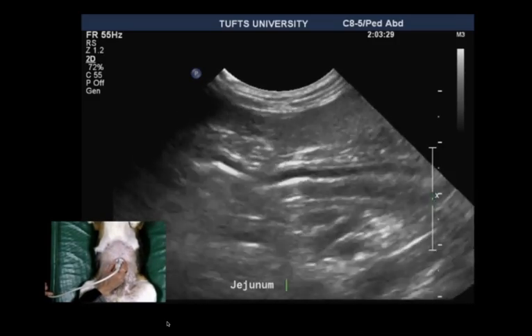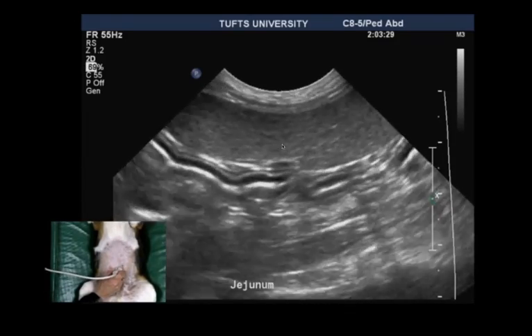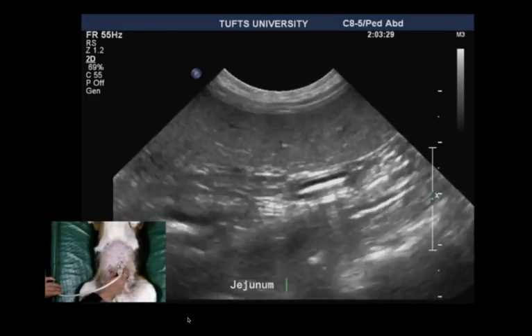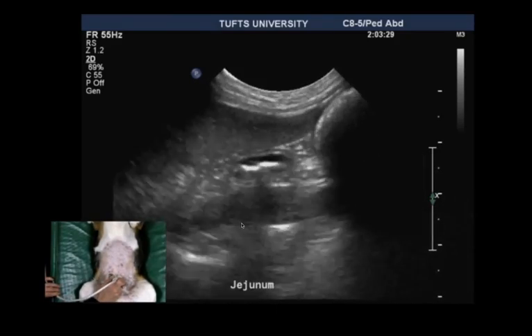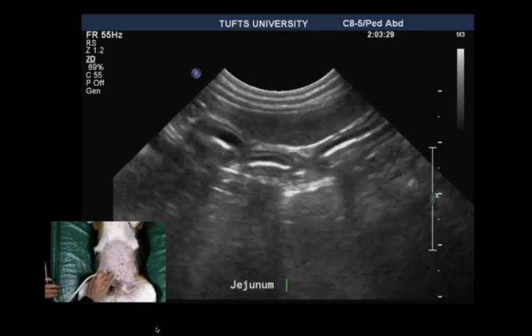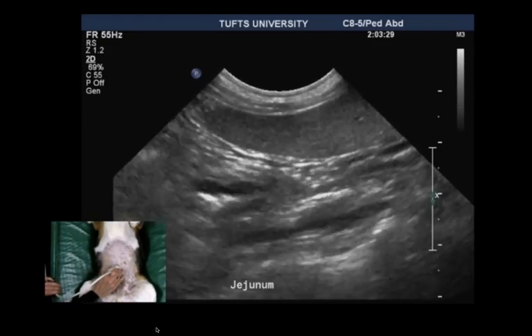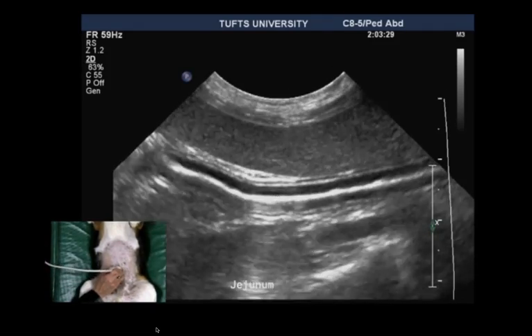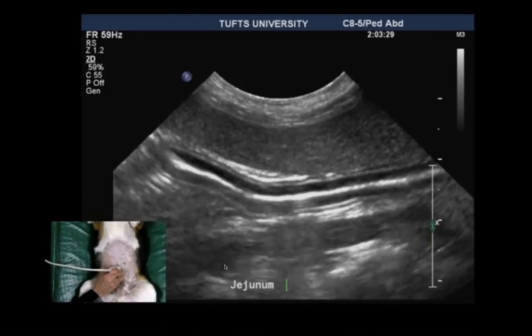Frequently, the spleen appears in the near field. And as we go to the left side, the descending colon can appear. Moving centrally, the aorta is now seen dorsally. The scanning will be stopped on a segment of jejunum to best evaluate its layering. The aorta is again seen in longitudinal plane in the far field.